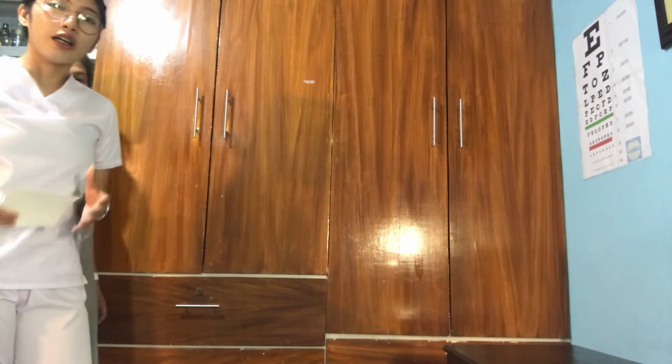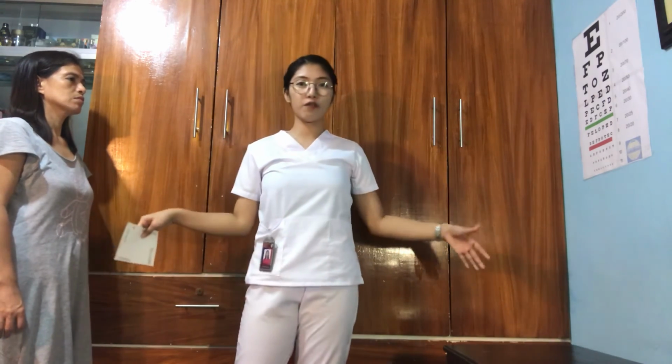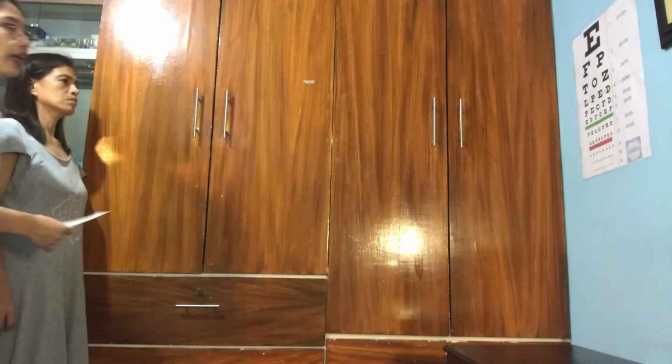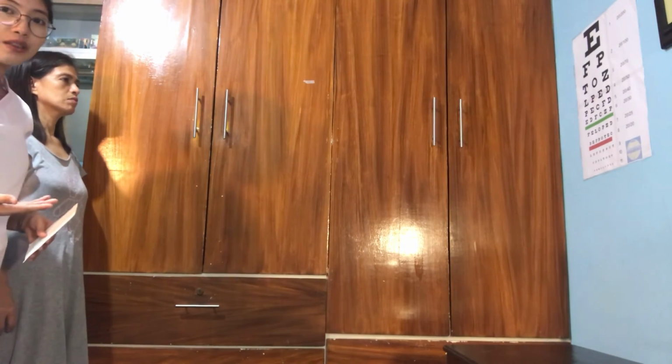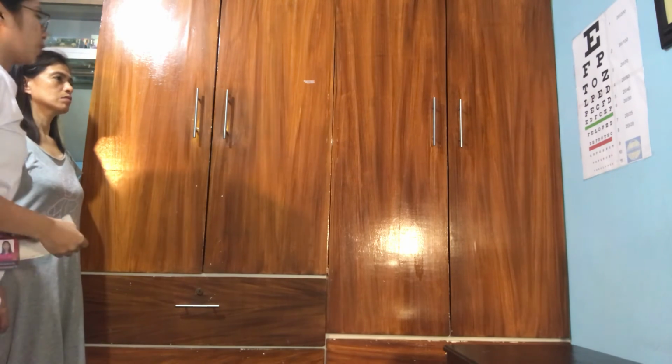So again, remember, in reading a Snellen chart, it should be 20 feet away. But since we only have limited space right here, we will just assume that it is already 20 feet away from the Snellen chart. So the first thing we need to do is to ask our patient to read the Snellen chart with both of her eyes. Okay po?